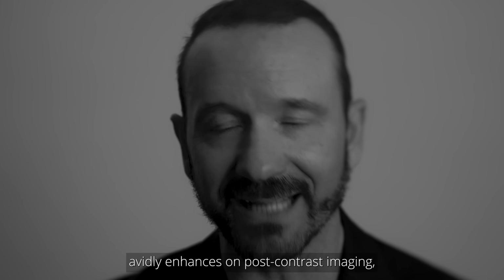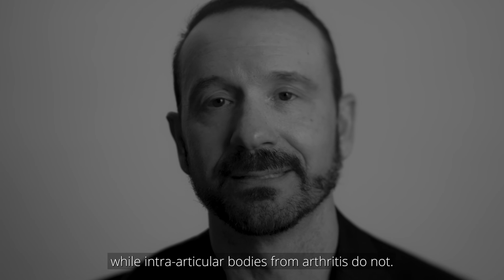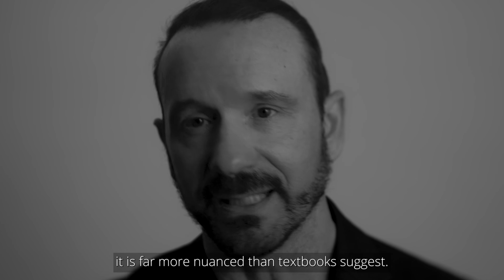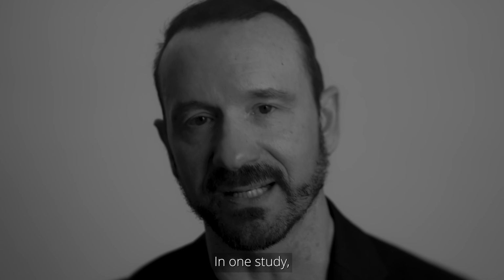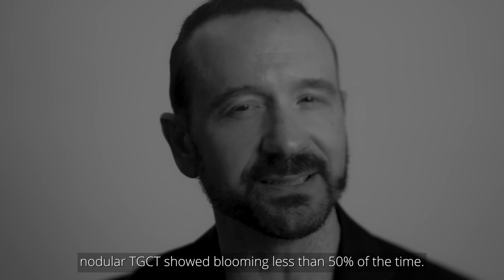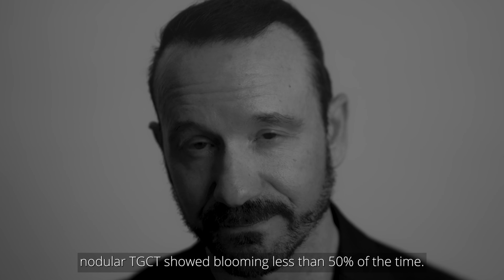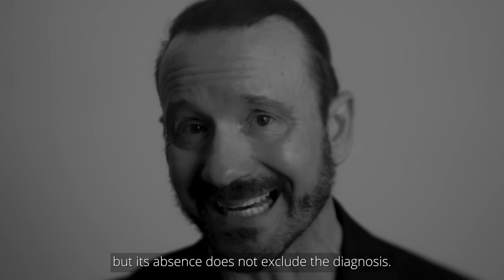TGCT avidly enhances on post-contrast imaging, while intra-articular bodies from arthritis do not. This distinction can be definitive. Regarding the GRE blooming artifact, it is far more nuanced than textbooks suggest. In one study, nodular TGCT showed blooming less than 50% of the time. It is useful when present, but its absence does not exclude the diagnosis.